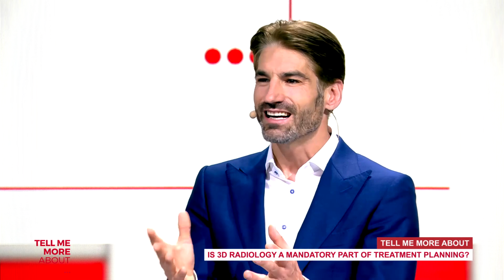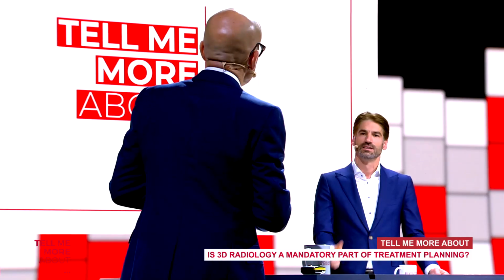Exactly. We can discuss the precision. And that's where you said the most important thing is, once a patient walks in, I better know how much bone there is. I better understand the landscape that I'm operating in. Absolutely, absolutely. All right. So that's the diagnostic phase. Then we go into the planning phase, and you shared some ideas about how I can come up with totally new concepts. I mean, we actually have 3 possibilities. We can do a static navigation, create a template with the software. Then we can do the so-called dynamic navigation, where you are guided during the surgery.